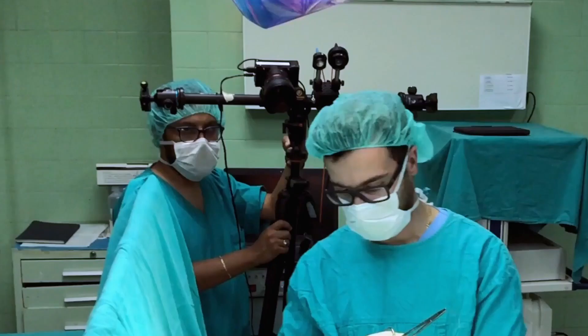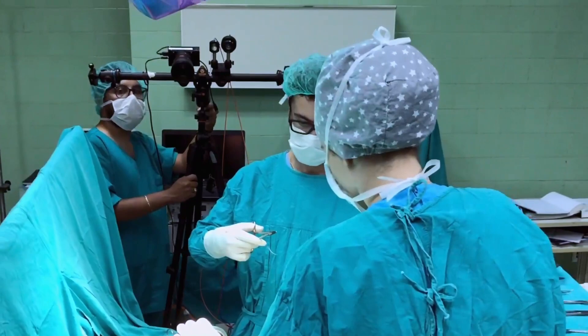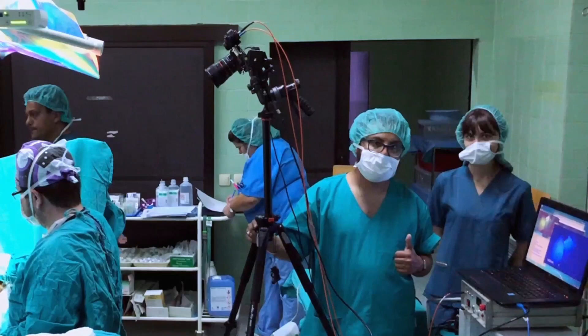Working then with surgeons at St. Cyril and Methodius University in the Republic of North Macedonia, we took our technology into the operating room. In patients with breast cancer, we demonstrated that our imaging system could detect sentinel lymph nodes, tissues that aren't cancerous by themselves, but can harbor microscopic cancer cells.